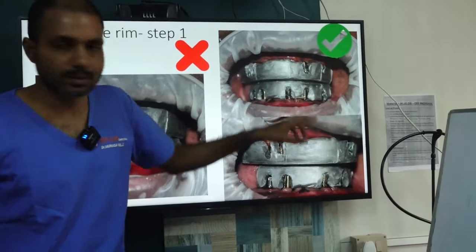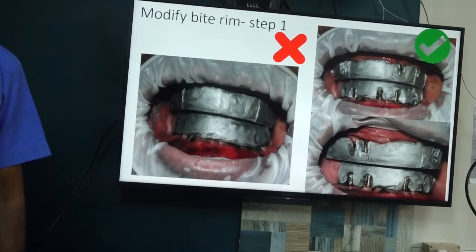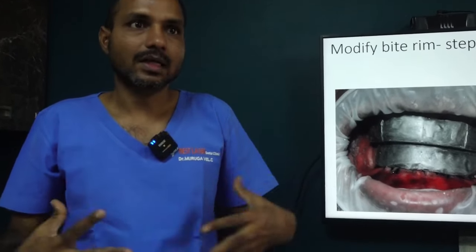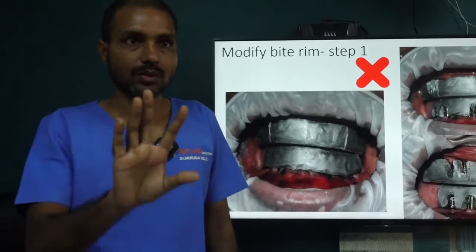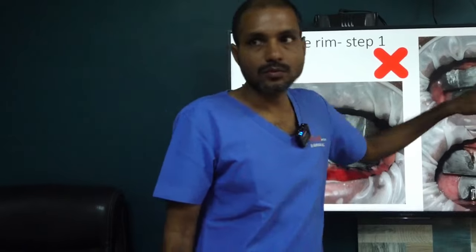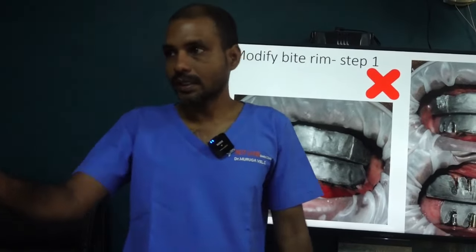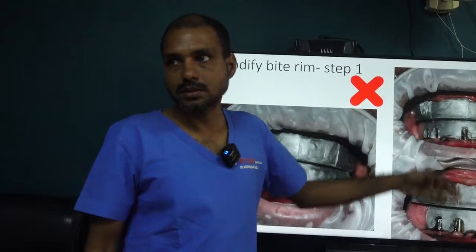Even then, if the neck is visible, that is enough, right? See, when you do the upper arch teeth scanning and lower arch teeth scanning, and you ask the patient to bite and scan, it takes fixed landmarks from upper and lower jaw and connects them. But here it is a bite rim. It cannot connect the bite rim, so it is searching for some good landmarks here and here so that it will stitch both. You understand the concept? There is nothing fixed here. It is pink tissue, it is a full block. If there is one tooth here and one tooth here, it will lock. Imagine this patient is having teeth on this side, upper and lower. It will take the bite, right? Because there is some landmark to connect this and this.